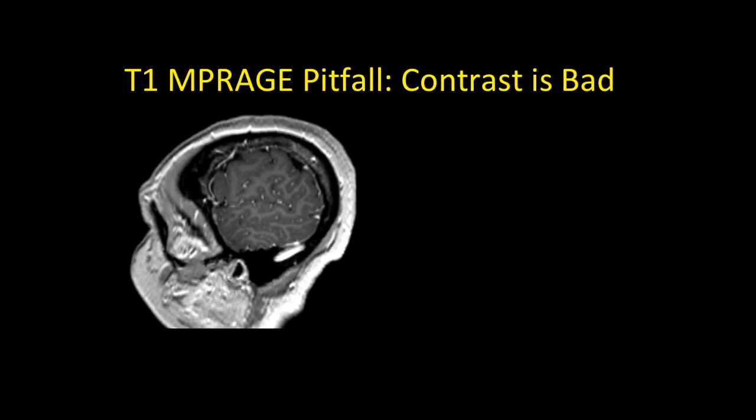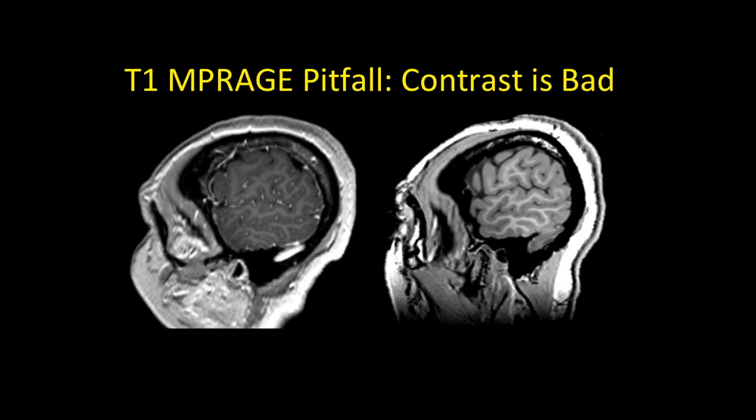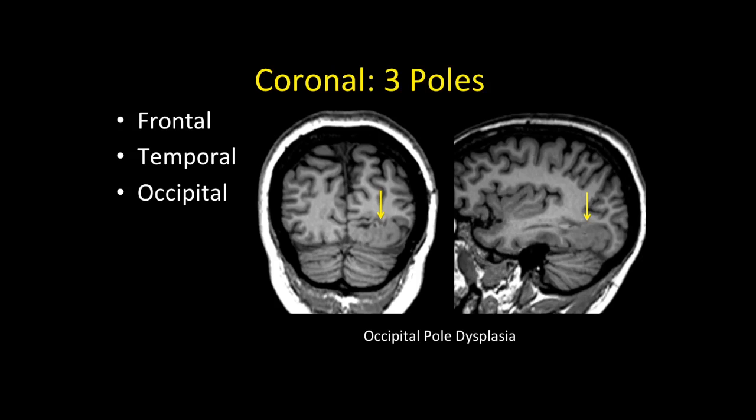A key T1 MP-rage pitfall: contrast is bad. Do not waste time acquiring or looking at post-contrast T1 MP-rage. The contrast is not optimized for finding cortical lesions, and enhancement in pial blood vessels often masks subtle lesions. As shown here, you cannot see the lesion on the post-contrast image, but on a regular non-contrast MP-rage you can easily see the subtle microgyria. Just say no to gadolinium — if post-contrast T1 is needed in your protocol, use a regular spin-echo 2D T1.